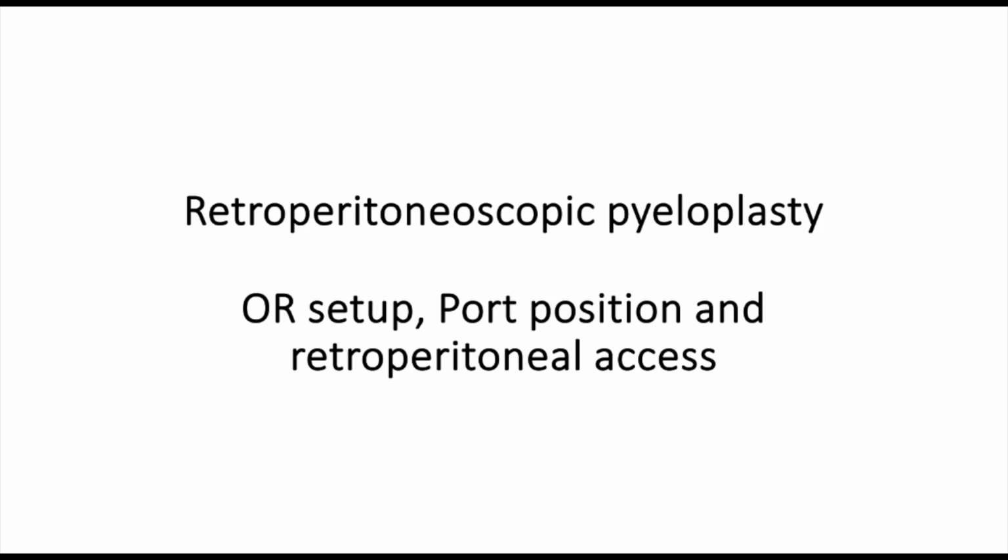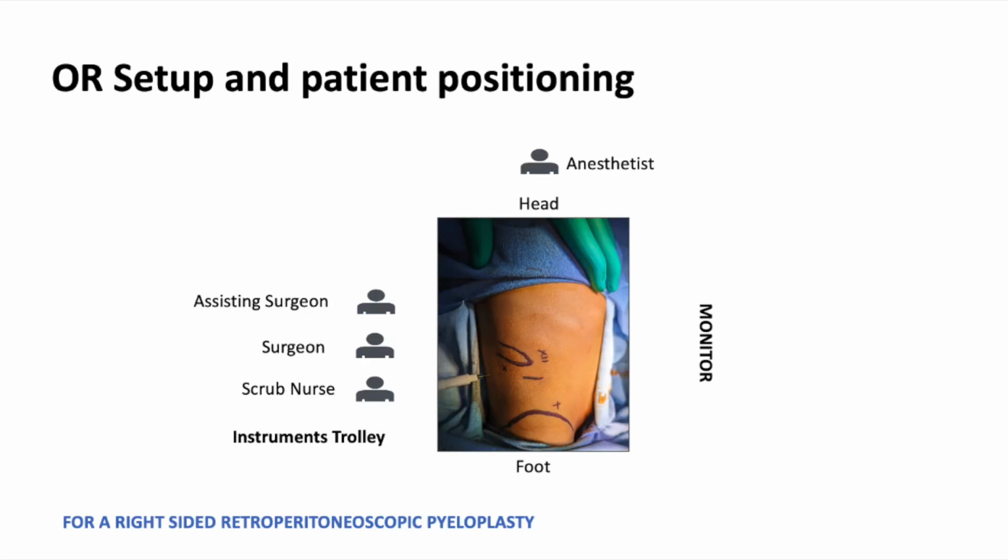Hello friends, in this brief video today, I will be discussing the details of operation room setup, port positioning and how to get retroperitoneal access in retroperitoneoscopic pyeloplasty. This is the template OR setup and patient positioning of a right-sided retroperitoneoscopic pyeloplasty.